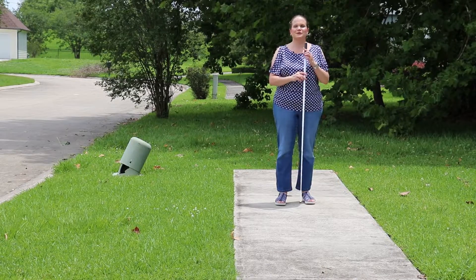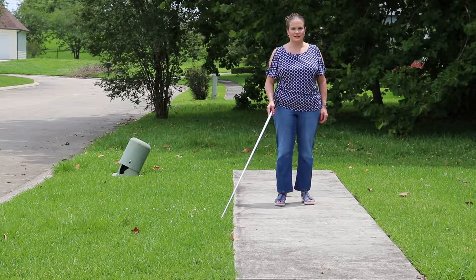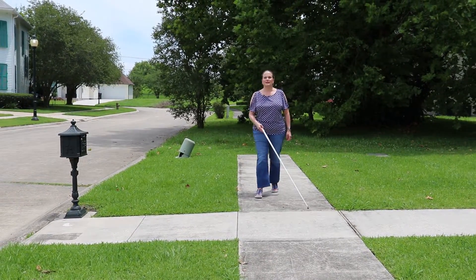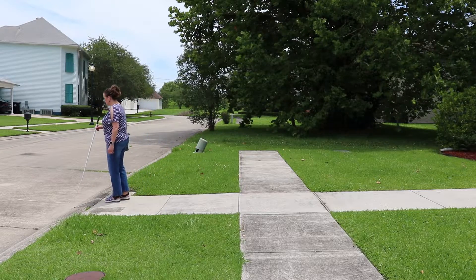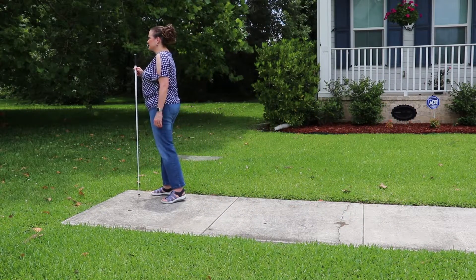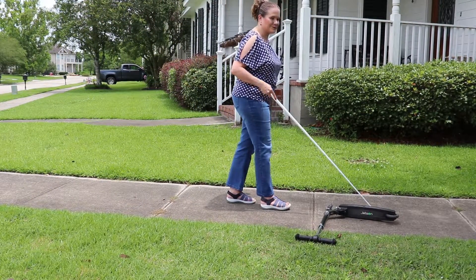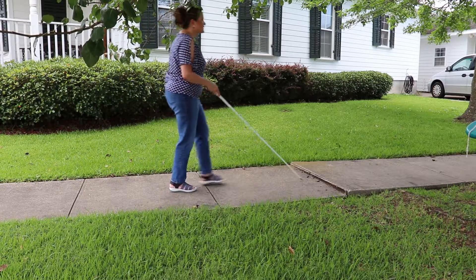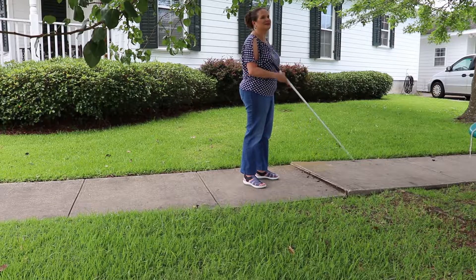There are many ways to get from one place to another while staying oriented and avoiding obstacles when using a white cane. One of the simplest methods is to follow a shoreline — where one texture meets another, like where the sidewalk meets the grass, where tile meets carpet, or where the floor meets the wall if you're indoors. The cane can also help you detect changes in terrain and detect obstacles that are in your way to keep you from tripping and falling. It can also detect cues and clues in your environment to help you stay oriented, like this low-hanging tree and this crack. Once I find them, I know exactly where I am in my neighborhood.